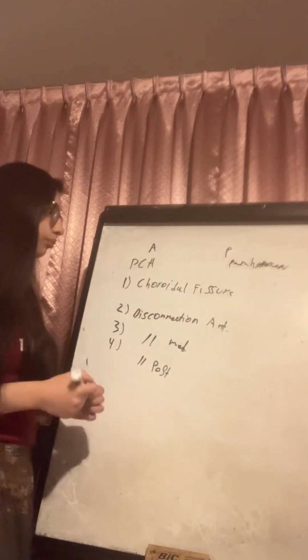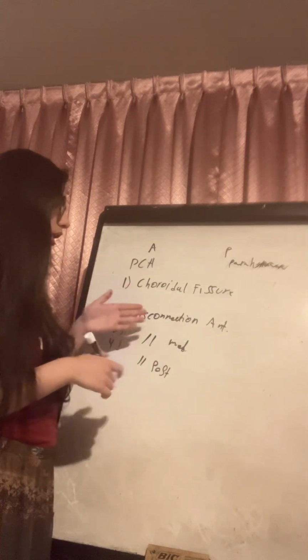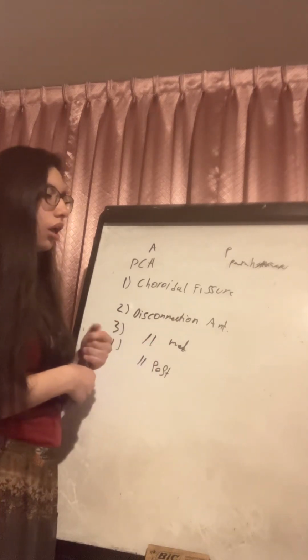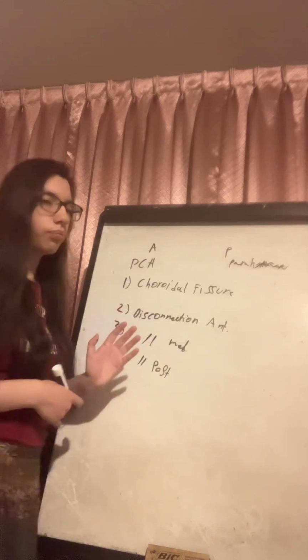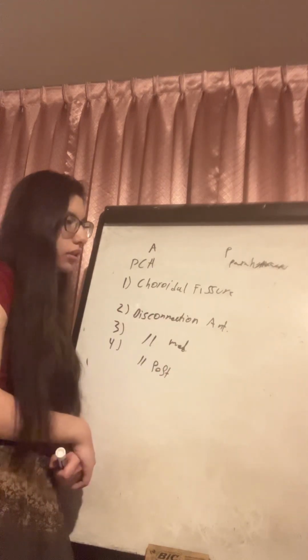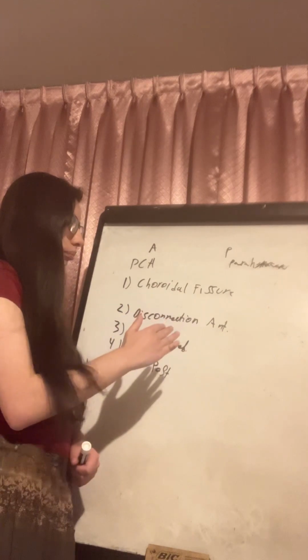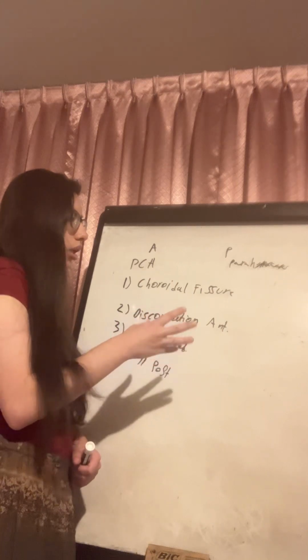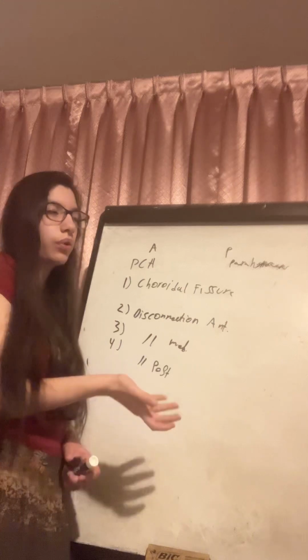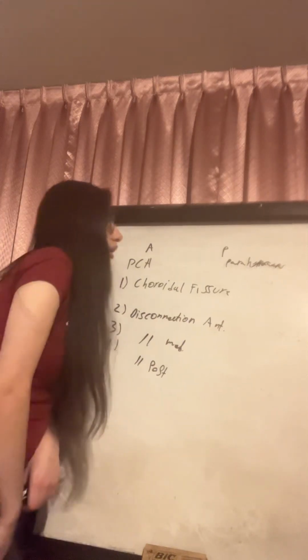Then after the choroidal fissure is opened, we usually find an intraventricular prominence, that is the one that is our landmark for finding the pulvinar of the thalamus. Then we continue with the anterior disconnection.